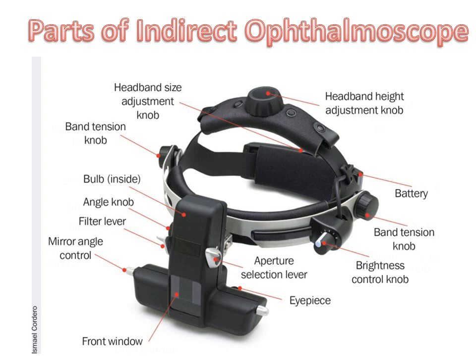For example, if the pupil is not very well dilated, then use a small aperture. If the pupil is well dilated, then you have a larger aperture. Just like you have a cobalt blue filter and a red free light which are present in direct ophthalmoscope, the same way you have all those color lights here.